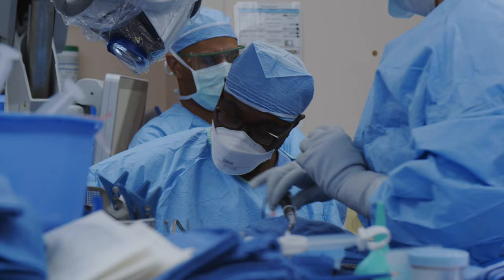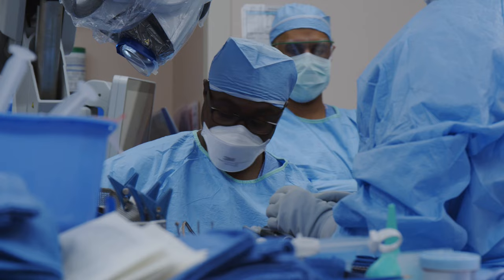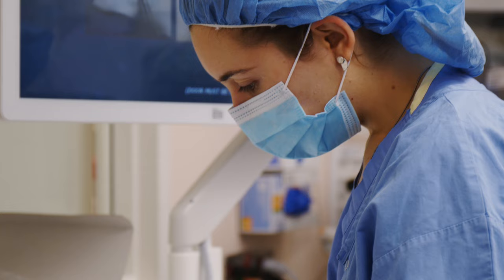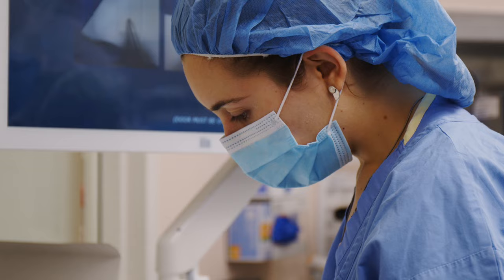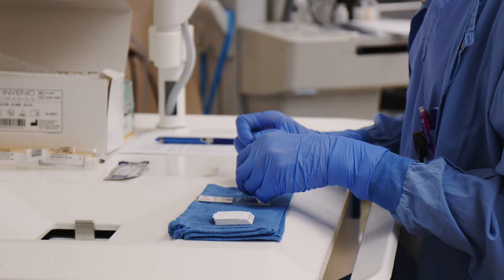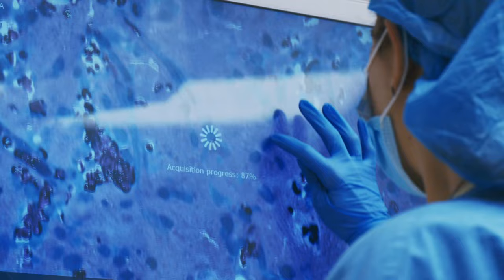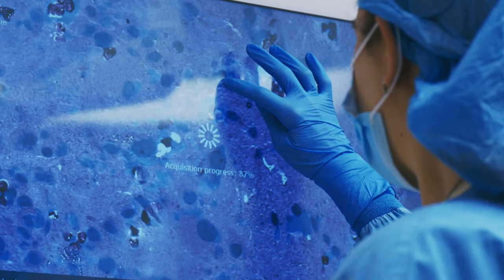One of the benefits of being at University of California, San Francisco is that we get to study disease processes in the most comprehensive way we can think of. In this particular operation, one of the ways we study it is to look at the tumor tissue through an optical imaging tool called stimulated Raman histology. A piece of tissue is put on a slide and you look at the scattering of light, which is decoded into images that look like histology images, and they help us understand how close we are to the margins of the tumor.